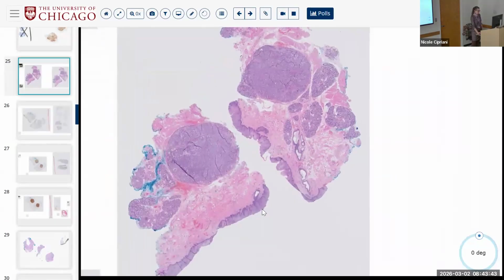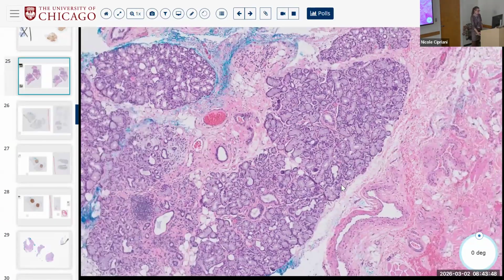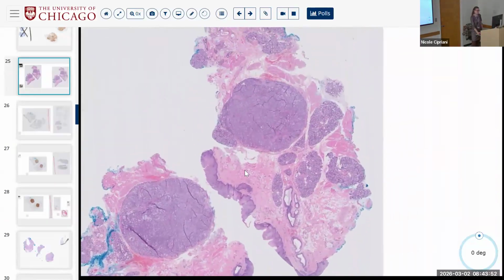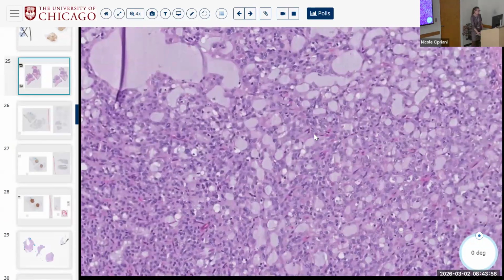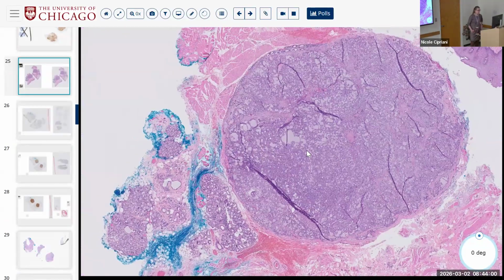Another minor salivary gland, very mucinous, potentially also palate. Very circumscribed, like a cannonball. What's different now? Does it have this multilobulated cloud-like phenotype? No, pretty uniform and rigid.